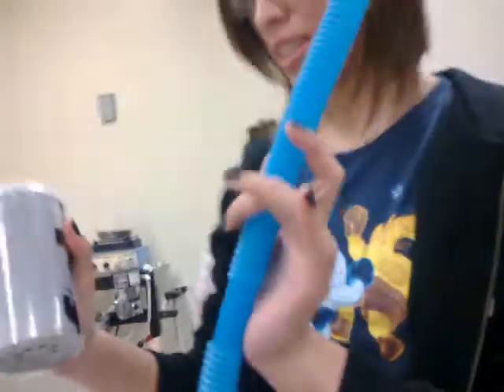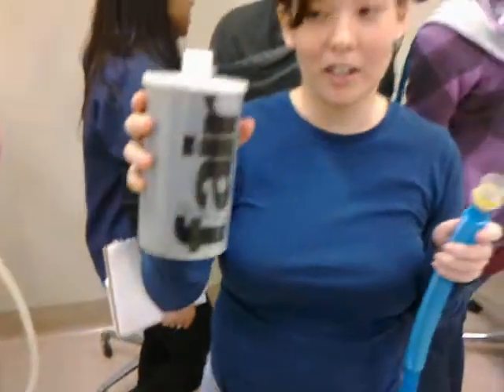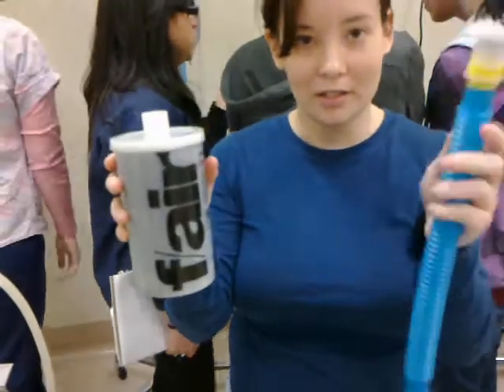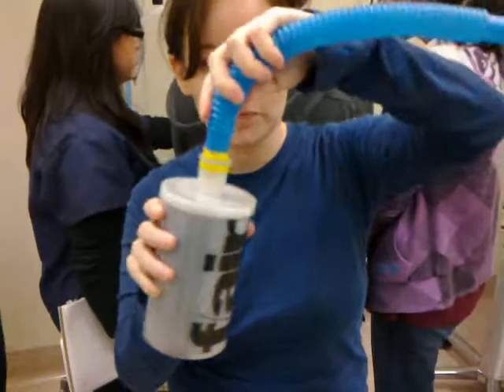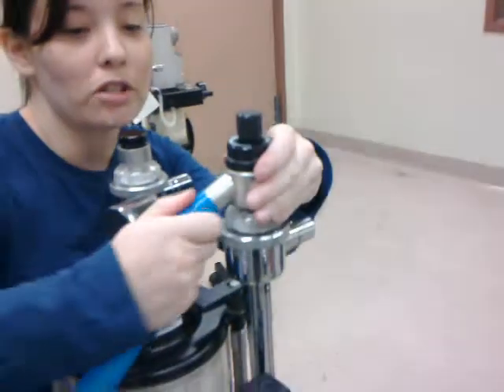Now we're going to connect and put everything together. The anesthetic scavenger canister — scavenger system — gets connected and put on the back of the machine. This end of the tube goes up here, which is attached to the expiratory valve here.